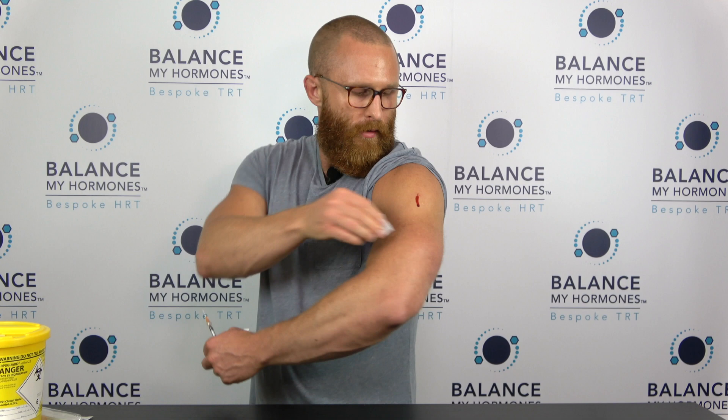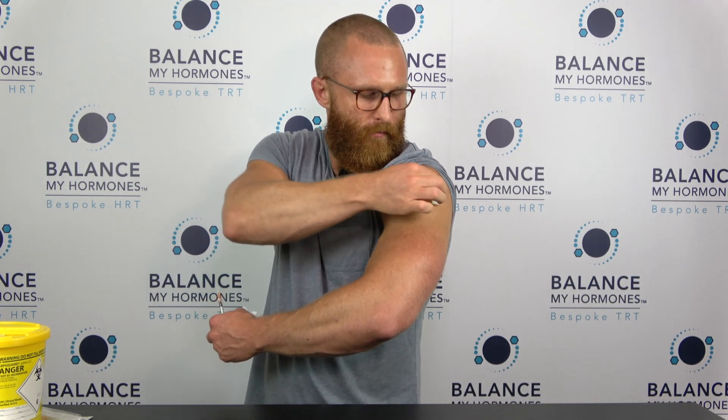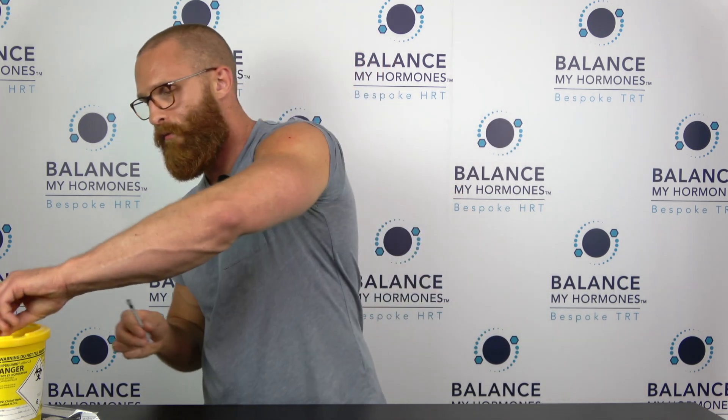You may have a little droplet of blood as I do — just give it a wipe, put some pressure on it, and you're done. Discard the needle in the sharps bin.